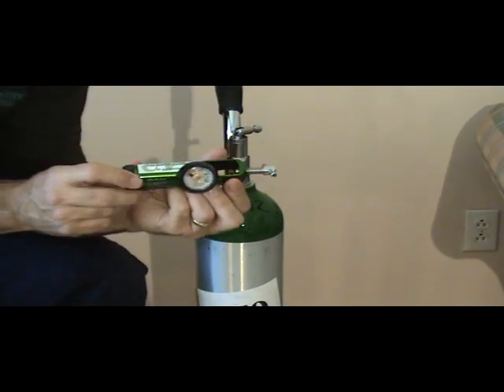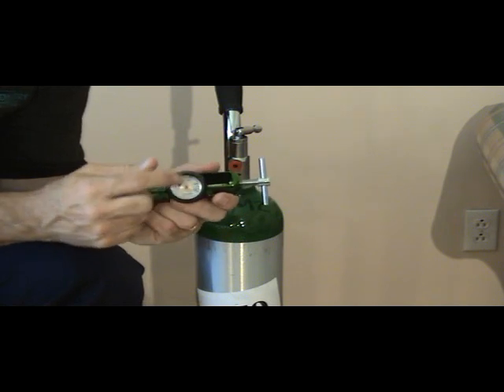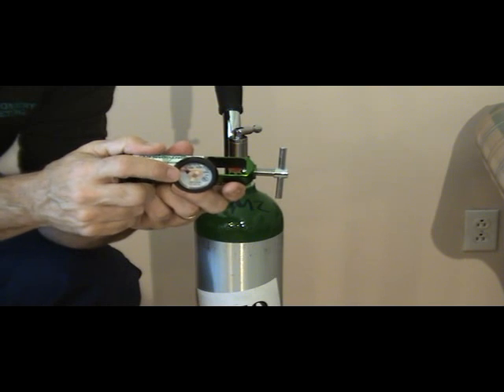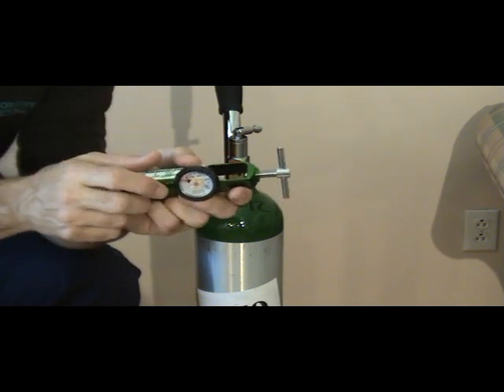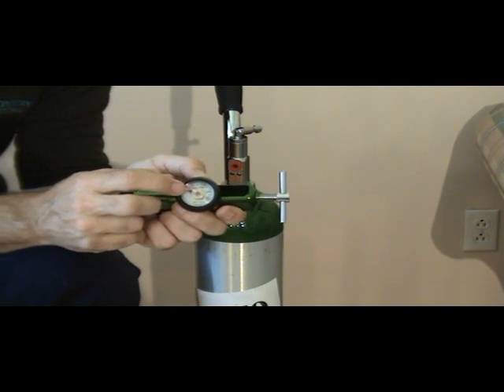This is your regulator. The regulator has a T right here that turns and closes it onto the bottle. It has a gauge right here. The gauge, if you look at it right now, will show you that the arrow is pointed into the red area, which is 0, which would indicate there was no air in the tank. It was not hooked up to the tank. When you hook it up to the tank and you turn the flow on to the regulator, the arrow should go up into the green area where it indicates 2,000. This would indicate a full tank. 2,000 indicates a full tank. If the arrow was at the 1,000 level, that would be half a tank.